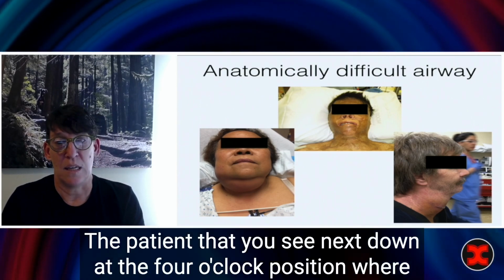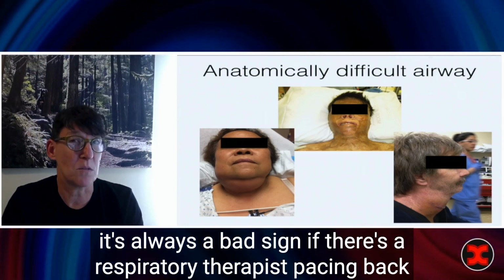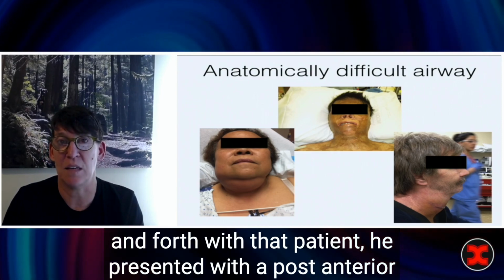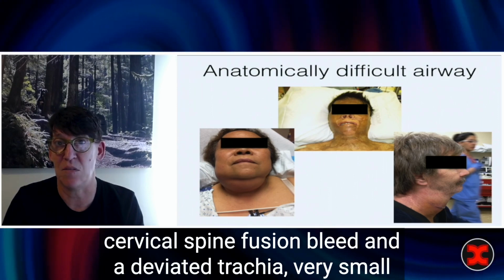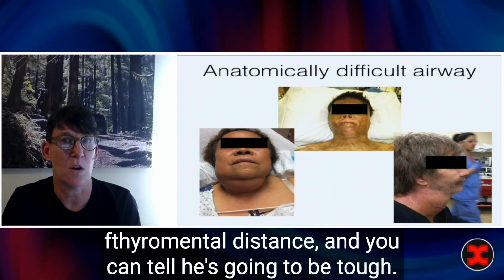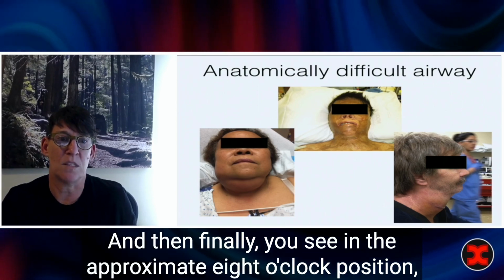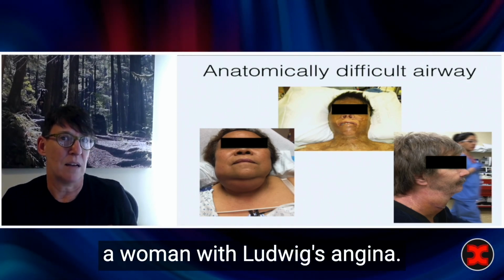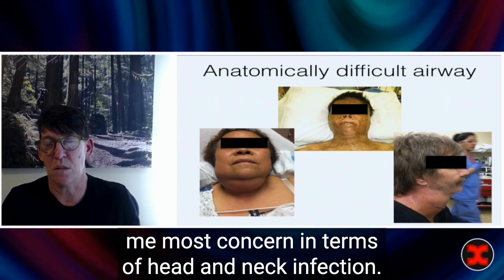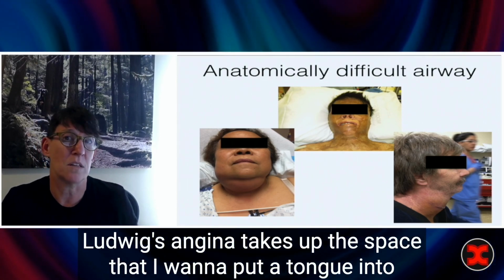The patient that you see next, down at the 4 o'clock position, where it's always a bad sign if there's a respiratory therapist pacing back and forth with that patient, presented with a post-anterior cervical spine fusion bleed and a deviated trachea. Very small thyromental distance, and you can tell he's going to be tough for all those spheres again. And then finally, you see in the approximate 8 o'clock position, a woman with Ludwig's angina. And in my opinion, Ludwig's angina is the thing that makes me most concerned in terms of head and neck infection. Ludwig's angina takes up the space that I want to put a tongue into.